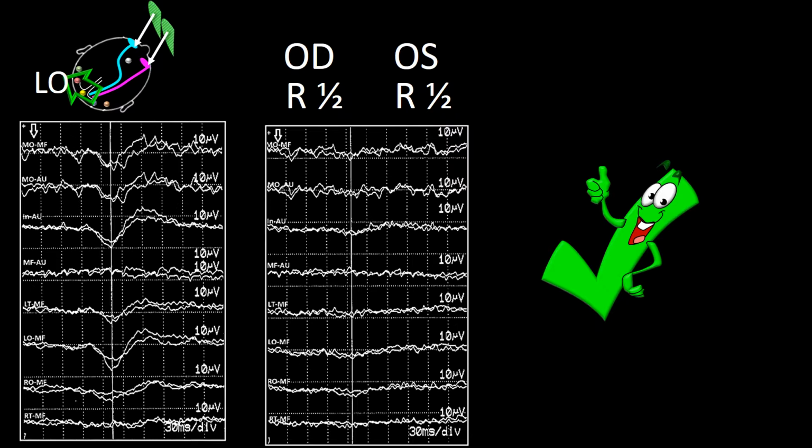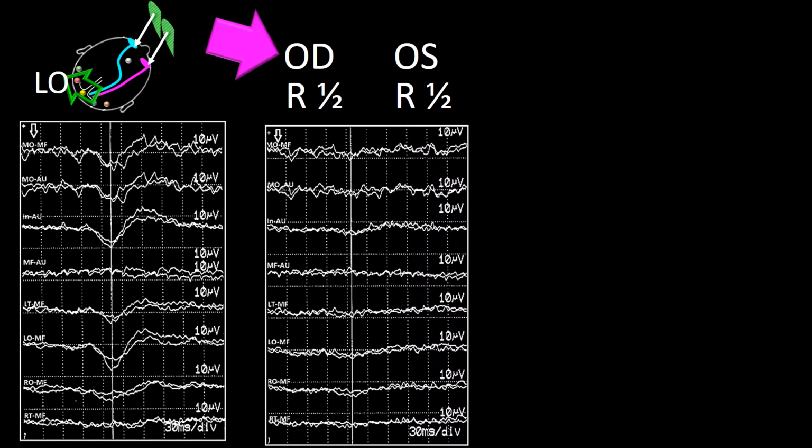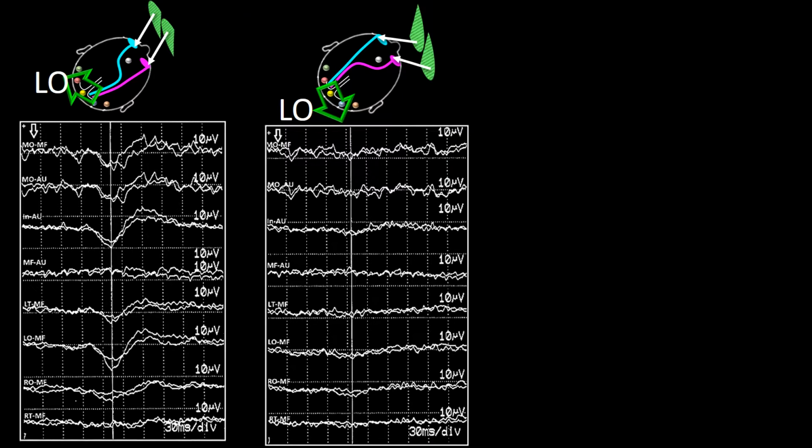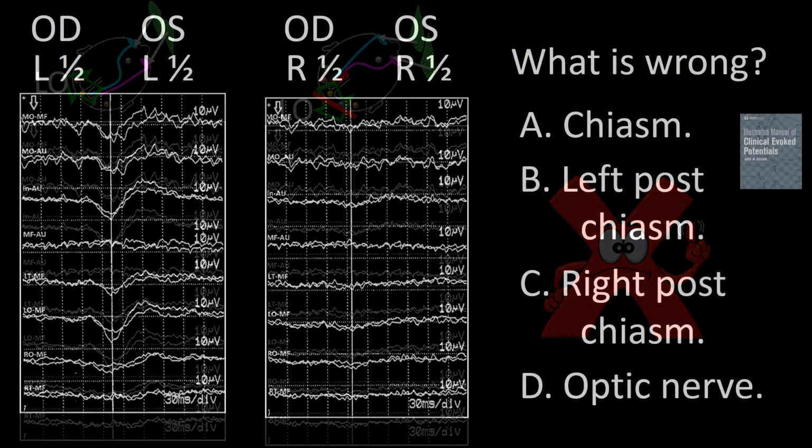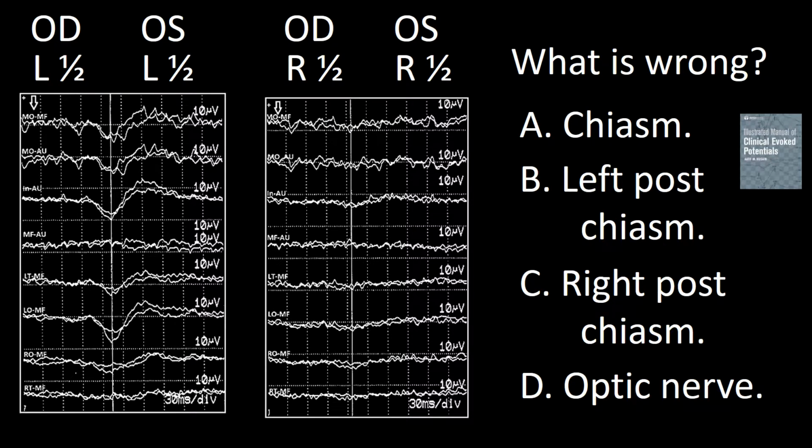And it is normal. In the next panel, I have done the same representation, but it is abnormal because, as you can see, no waves are present. So the answer to this question is B.